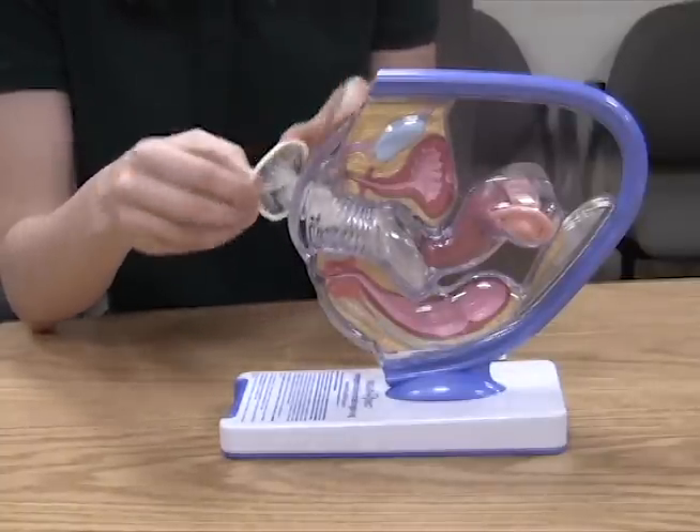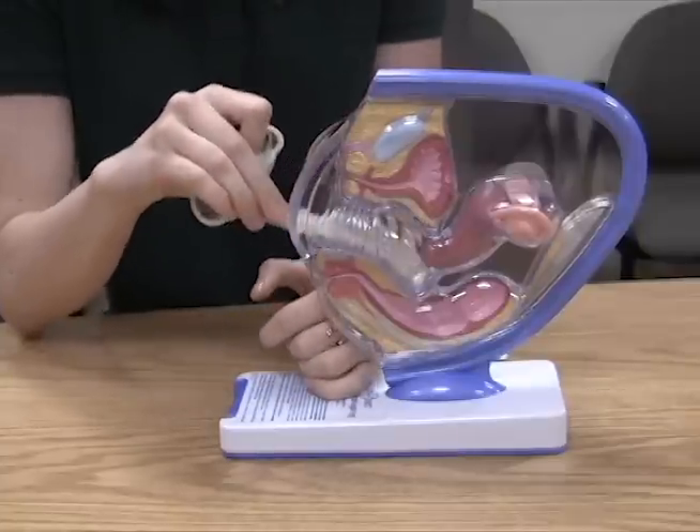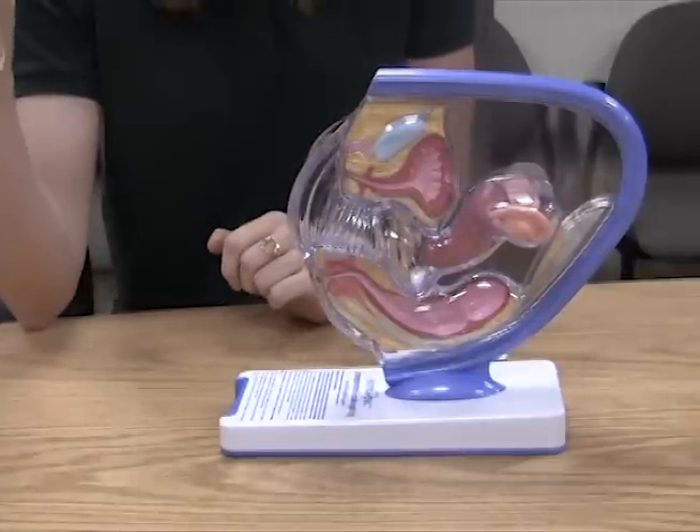After ejaculation, you're going to twist the outer ring, and to remove, you would pull it through the vagina and dispose of it in the trash can.